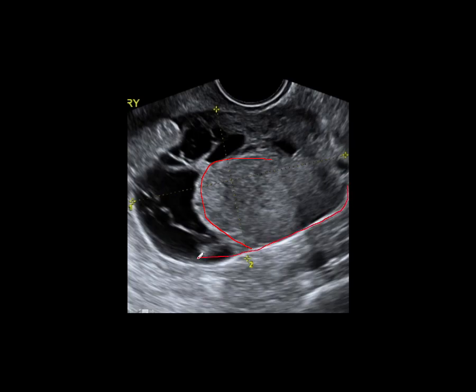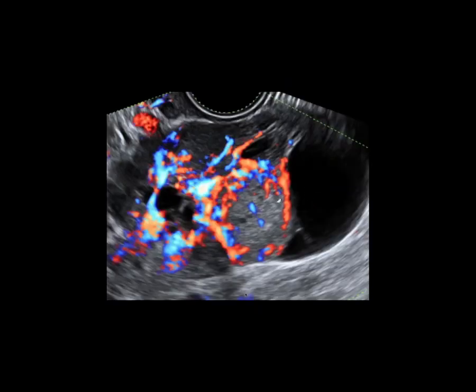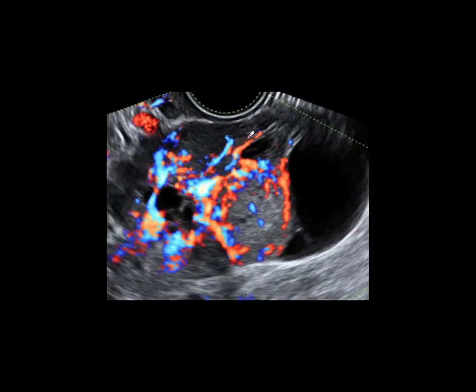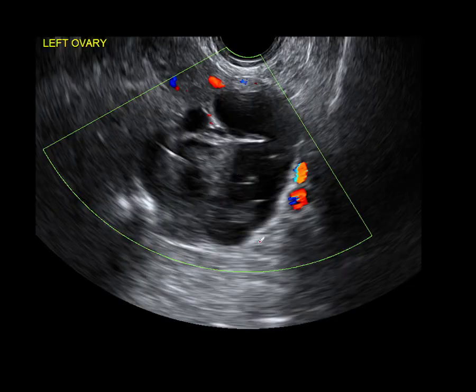So this border of the lesion is quite smooth, but there's something funny going on over here outside of our view, and we're not quite sure what's going on here. I'm not sure, and we've got very dense flow internally. Okay, so this rather looks a little bit lobulated, perhaps out there. We're not catching the edge of it, and this is why it's important to try and interrogate the whole lesion if you can. Again, we have dense flow there with a branching pattern.